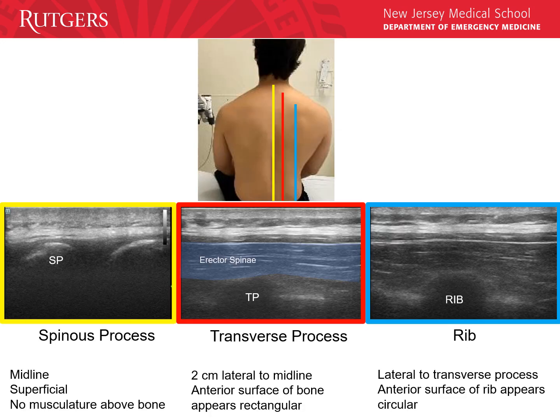Scan with the linear or curvilinear probe in the sagittal plane to identify your landmarks. The selection of using the linear or curvilinear probe depends on the patient's body habitus and how well you can identify your landmarks. Be aware that the spinal needle might not be well visualized with the curvilinear probe.